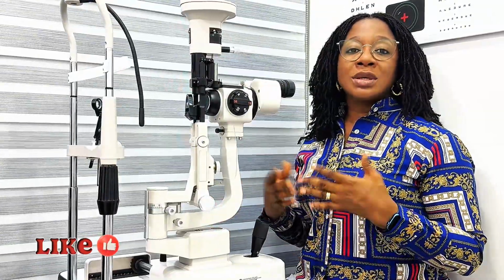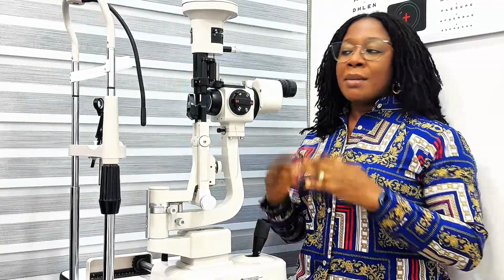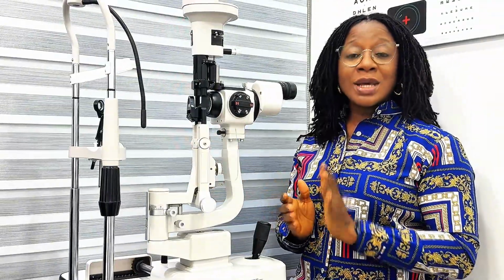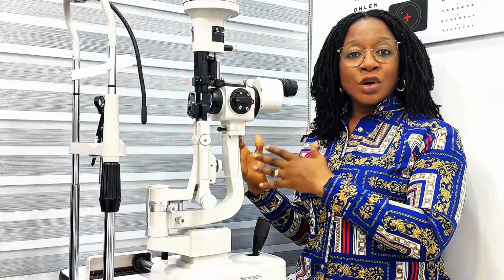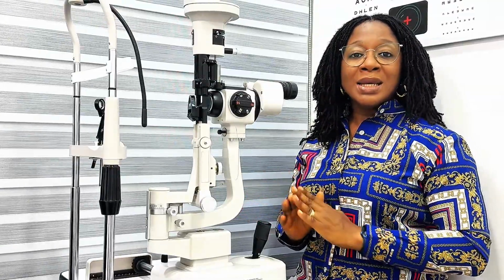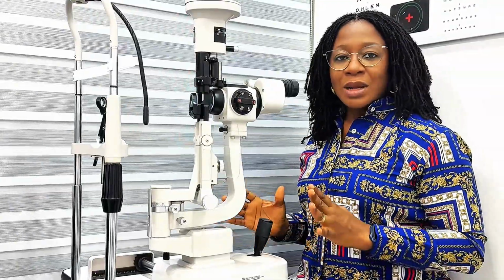You can use the OCT, you can also use the gonioscope. But for instance, if you perform the Von Herick technique and you find out that your patient's anterior chamber is shallow, that's a good time to go ahead with your gonioscopy to find out if your patient is fit to be dilated. So let's get right into it and perform this technique on our patients.